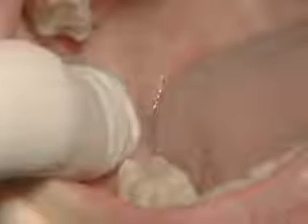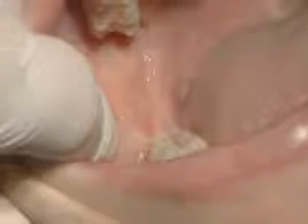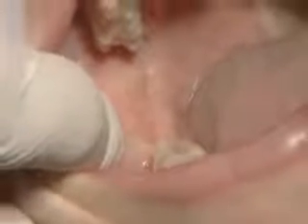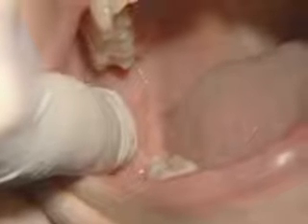The patient needs to open her mouth wide, and the first point that is palpated is the anterior border of the ramus, and specifically the coronoid notch of the external oblique ridge, and that is where my finger is resting right now. You then should move your finger in medially to feel the internal oblique ridge, and that marks an important landmark because it is just medial to this point where the needle will be inserted.